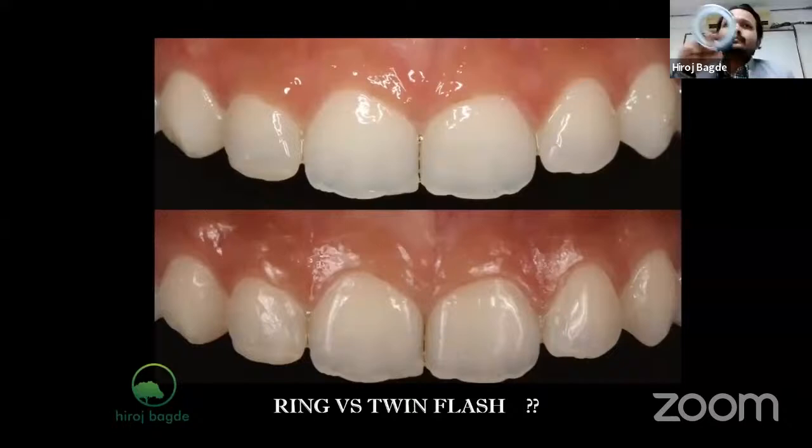Whenever I'm doing a case of anterior restorations, as in this case, I get a good image if there is a contraster behind it, because it gives a good contrast of the white and the black. If there is a tongue or the palate inside, it will distract the image. In such a case, the patient or the clinician can hold this contraster just behind the tooth, so that I can get a black background. This is just for aesthetics and can be skipped.